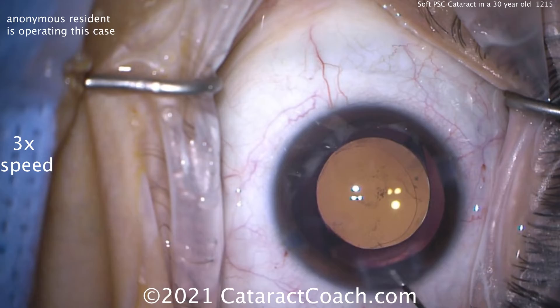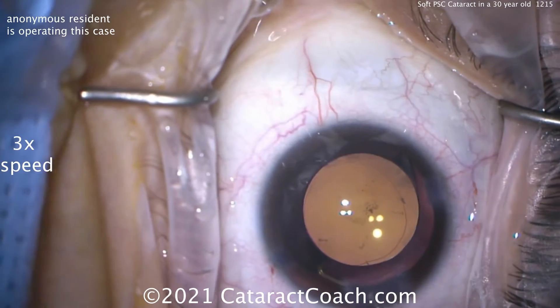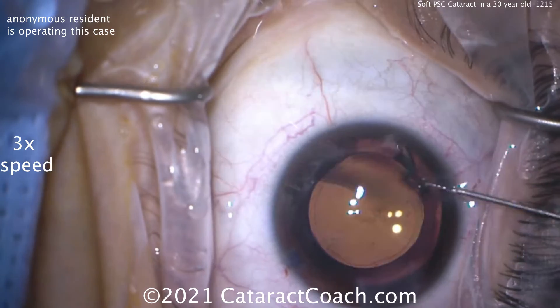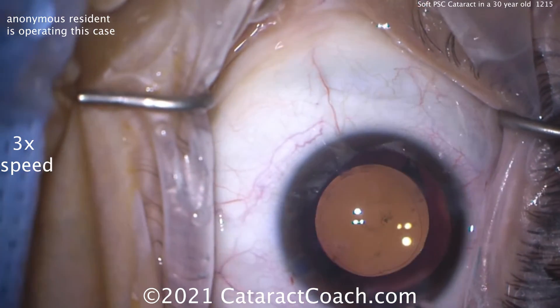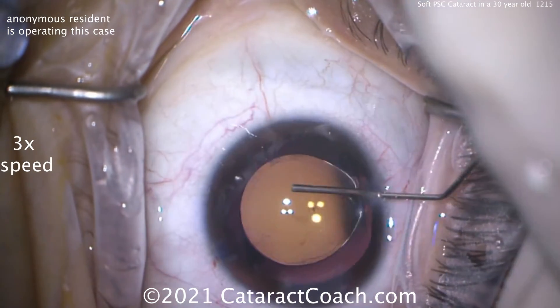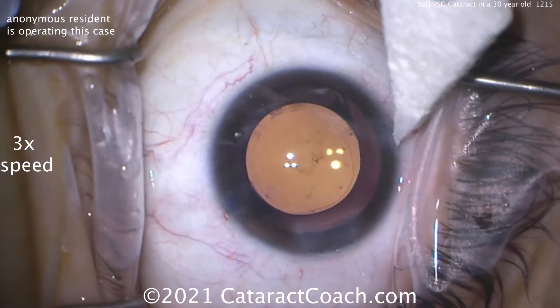Now we're going to settle that lens a little bit better. Look at the outline of the incision — that looks great. This patient is going to have a beautiful long-term seal with a good incision. These young patients — we really have to spend the extra time to take pride in our work. There's the overlap. Look at that 360-degree overlap. Good job, young resident. Good overlap of the optic by that capsule rhexis, all 360 degrees. The rhexis does cover — it's about a 5.5mm rhexis and it's beautifully centered. I'm impressed. So I'm sealing up the incisions here.